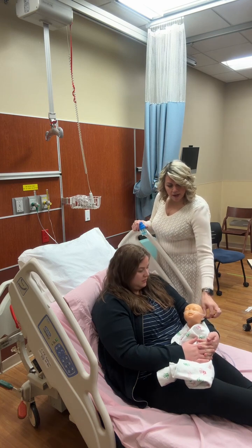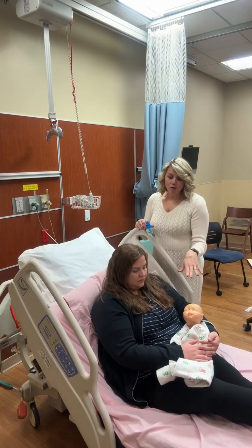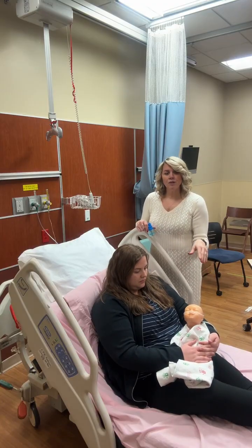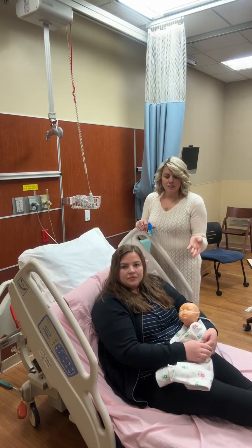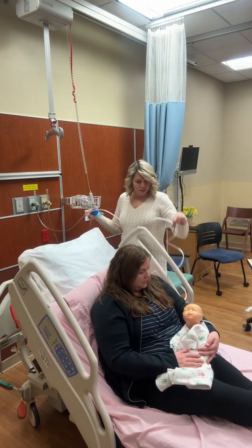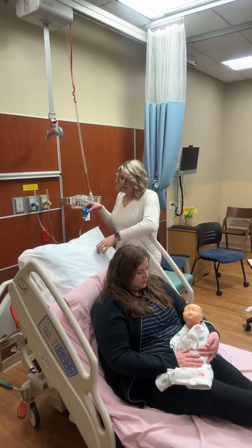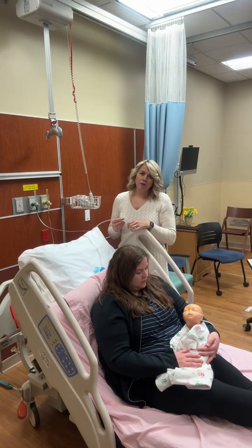of it is at the back of her head so that it's not underneath her neck. And so this is how you will see it in the sim lab as well when your infant patient is on a nasal cannula. Right now the baby is connected, and you know, I always tell people make sure that you're checking the integrity of your equipment.